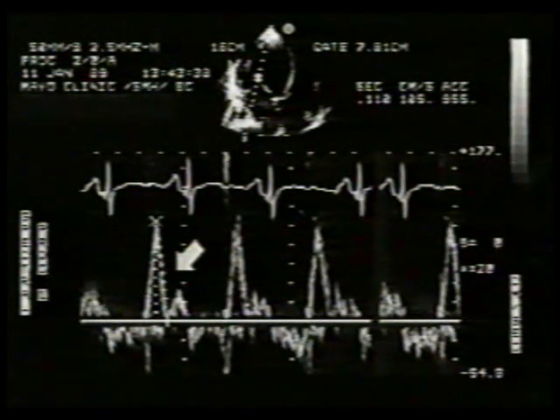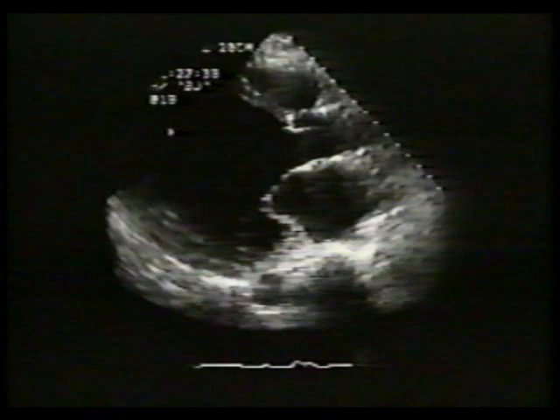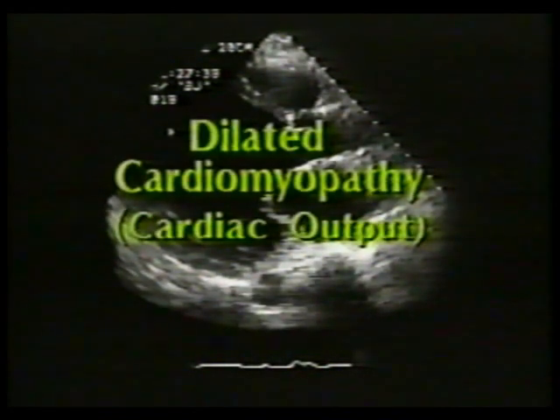It is usually associated with a more symptomatic state and likely indicates a poorer prognosis. It is important to note that dilated cardiomyopathy patients may be converted from one diastolic pattern to another with progression of disease, as well as by altering loading conditions.